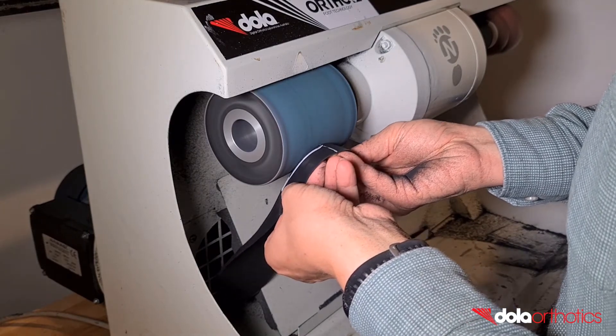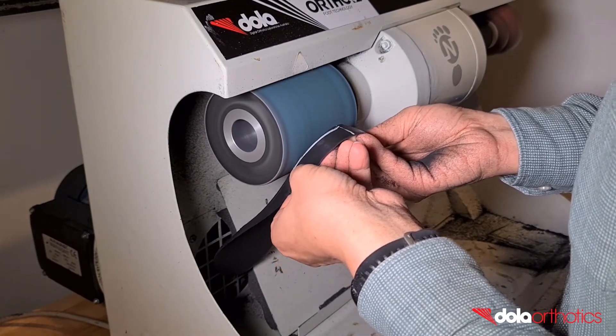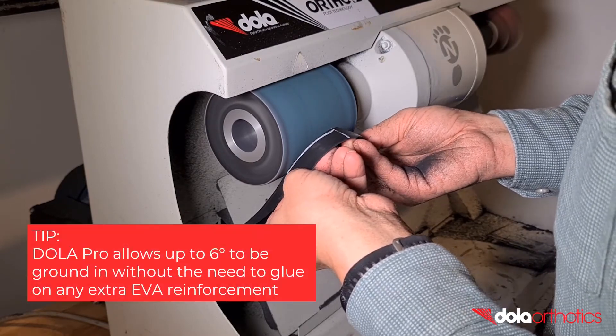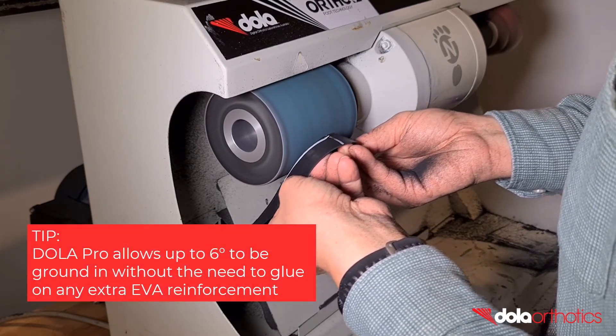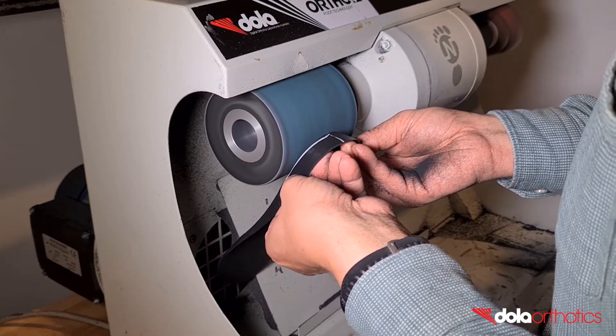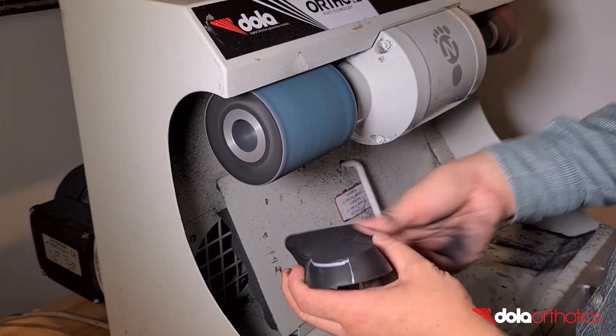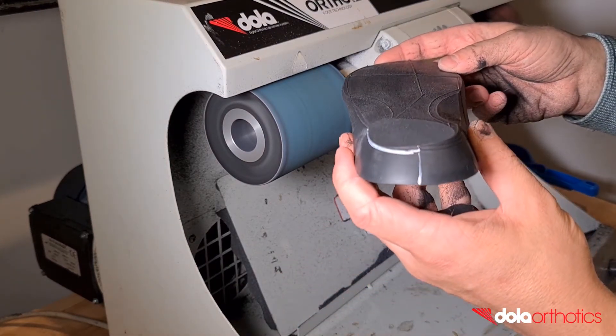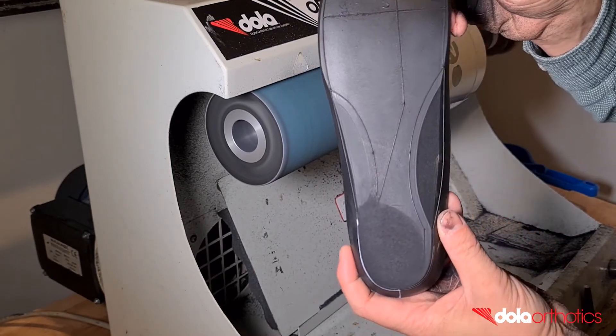Continue to remove material until your grind connects the lateral and medial sides of the rear foot post. The Dollar Pro allows practitioners to grind in a varus rear foot post up to 6 degrees without the need to glue on extra EVA reinforcement. Clinical markings including the heel bisection line and the rear foot post guidelines aid in symmetrical grinding and accurate prescription.